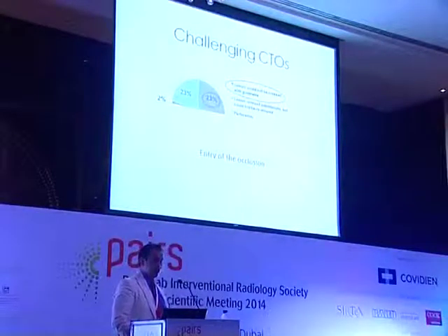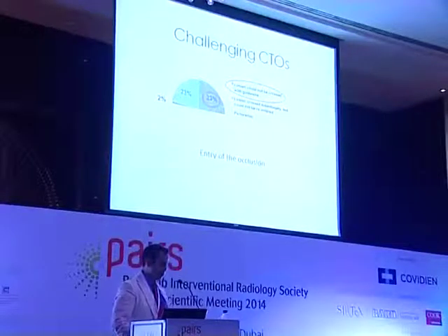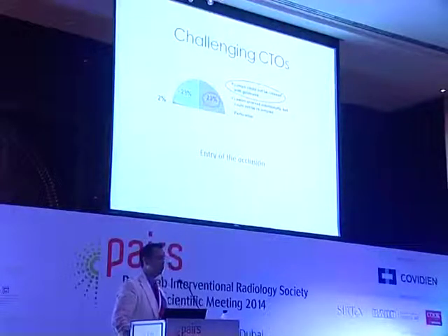In challenging CTO, we also have the difficulty of the entry of the lesion. I will show you just a way to puncture. It's not an alternate access, but it's just how to use the access to start the entry to the lesion.